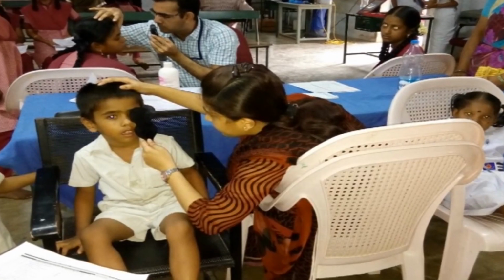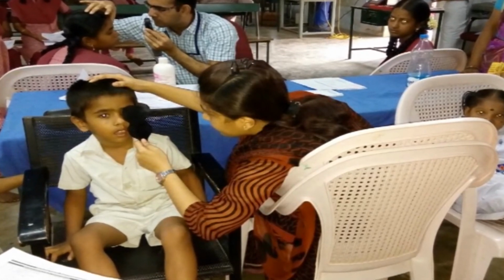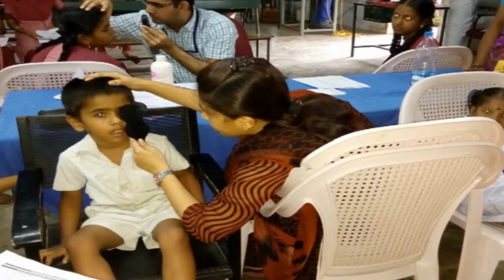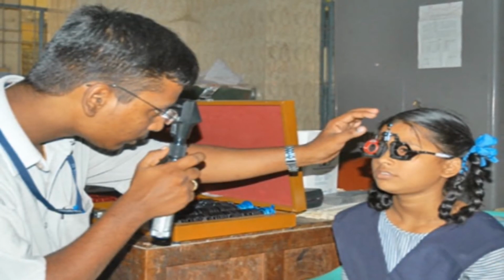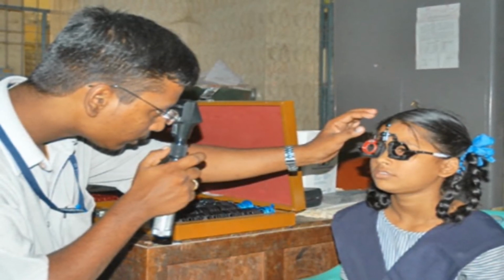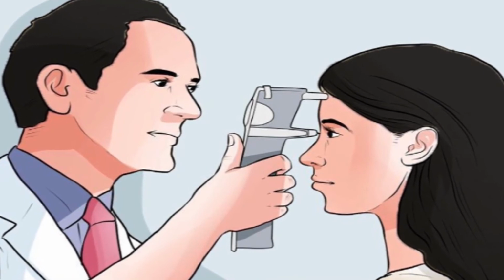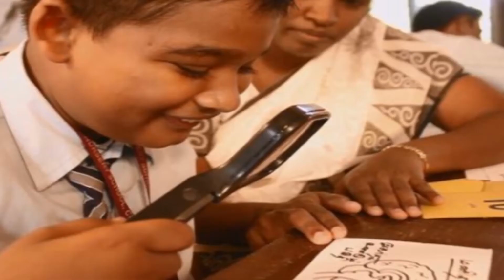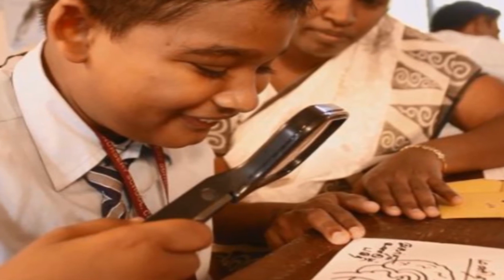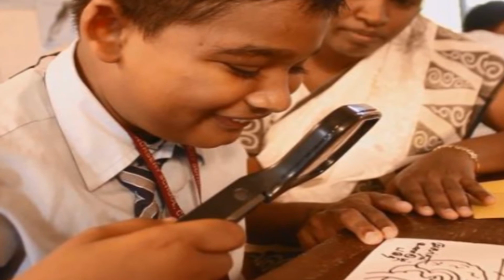The successful prescription of low vision devices for all children is dependent on a good knowledge of a child's case history and of the diagnosis and prognosis of his or her eye disease. Appropriate techniques should be used to obtain detailed information on children's refractive errors and visual abilities. The practitioner should also have a good understanding of the functions and features of the various low vision devices, and he or she should know how to select and apply the most appropriate low vision devices for the children to accomplish their various visual tasks.